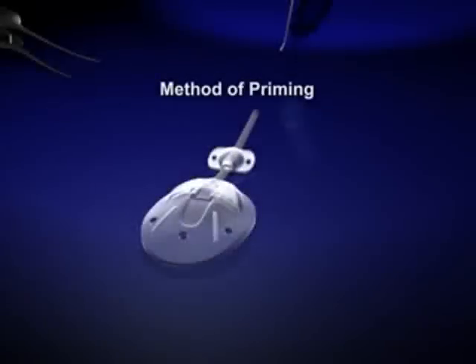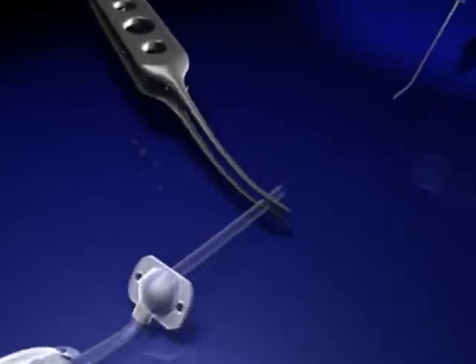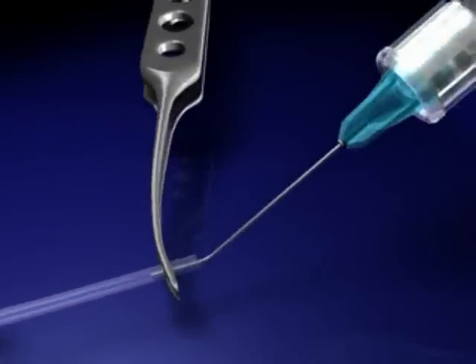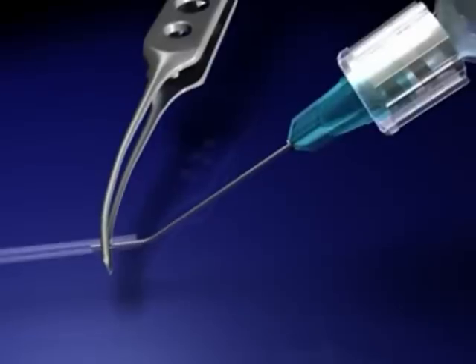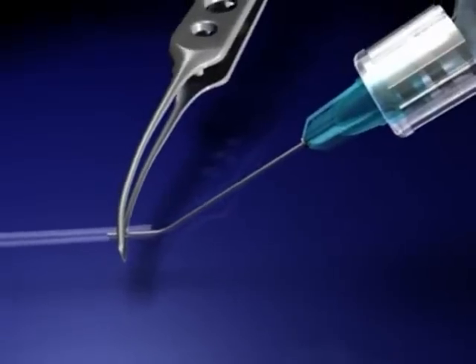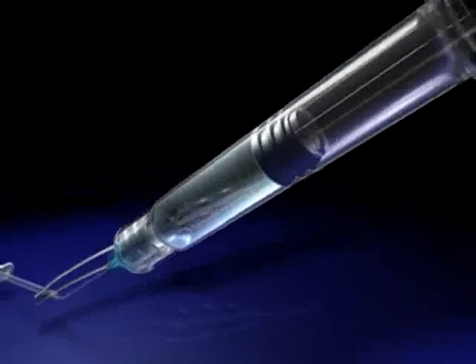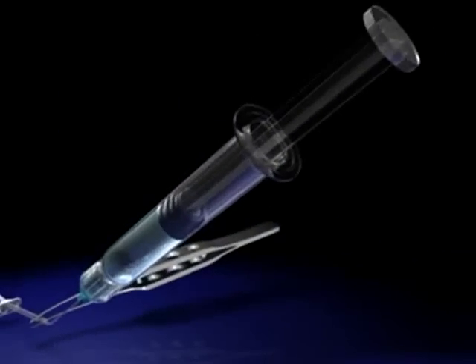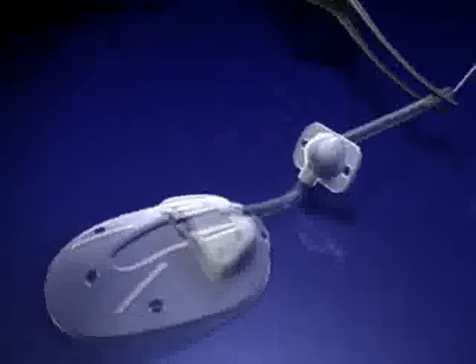Method of priming. Priming is accomplished by injecting 2 cc balanced salt solution or sterile water through the drainage tube using a 26 gauge cannula. A lot of force is required to push the fluid through the tube with the pars plana clip.